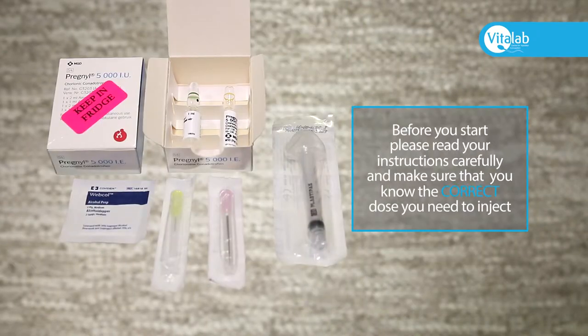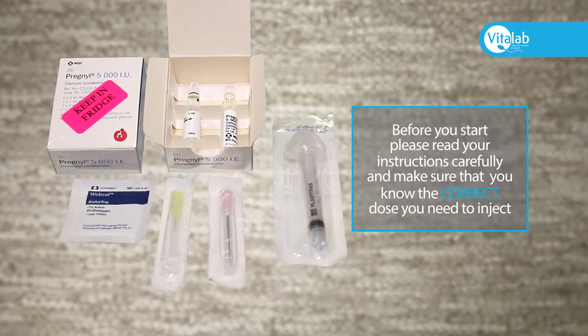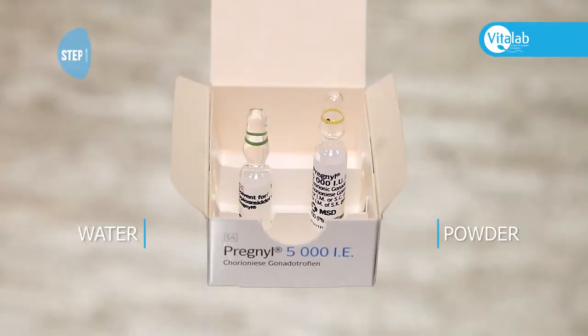Before you start, please read your instructions carefully and make sure that you know the correct dose that you need to inject. First, open the packaging. Inside you will find two ampoules: one with water and one with powder.